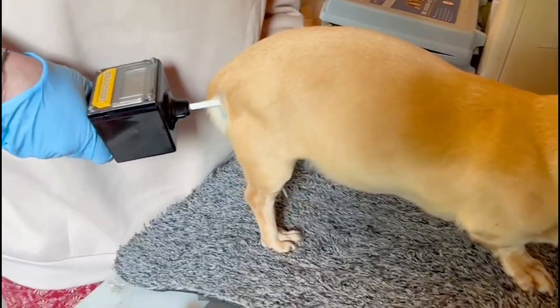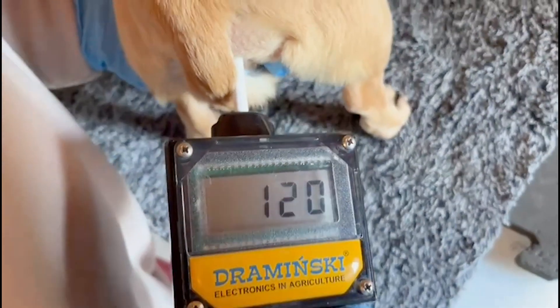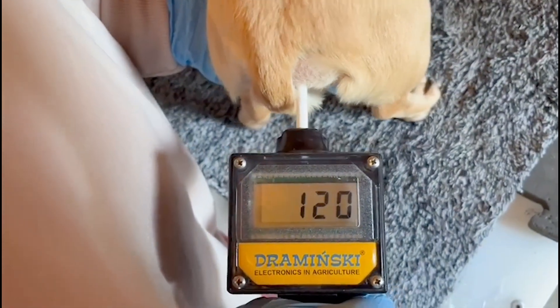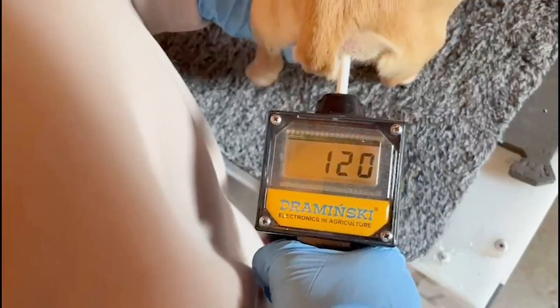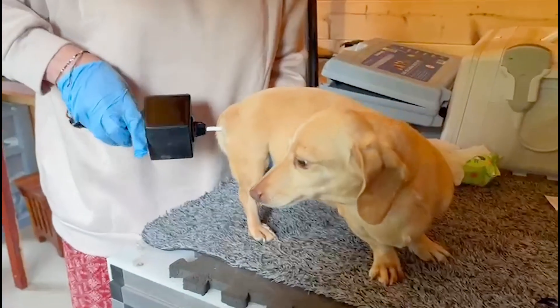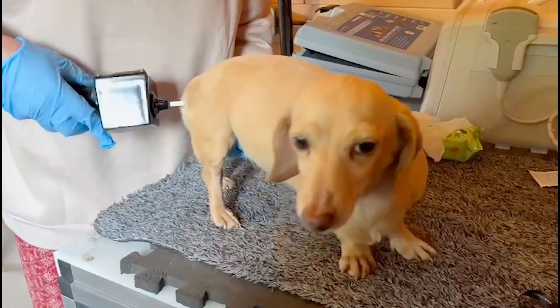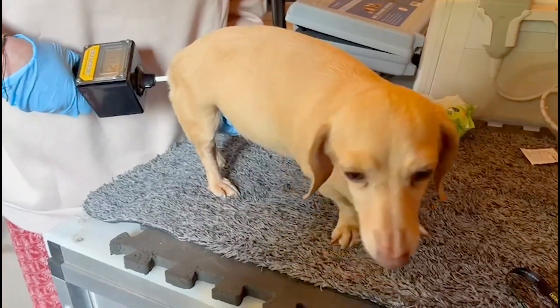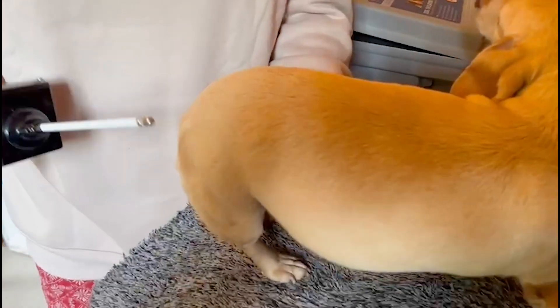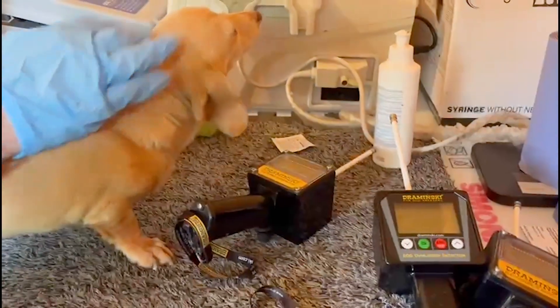You press it once and it gives us a number — 120 in this case, because Gracie is not in season. If she were in season, you would start at around 190 to 200. We usually do it three times, but I'm just going to do it twice so I don't upset Gracie too much.